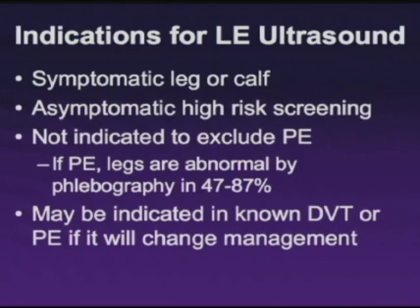First of all, in a patient with a symptomatic leg and chest symptoms, it may be prudent or quicker to do a venous ultrasound study, and if DVT is found, the patient should be treated and the presumption made that the chest symptoms are related to pulmonary embolism in the presence of known DVT. On the other hand, if the ultrasound studies are normal in a patient with suspected deep venous thrombosis, further evaluation is clearly warranted, as many patients with pulmonary embolism will have normal leg ultrasounds or normal venograms.